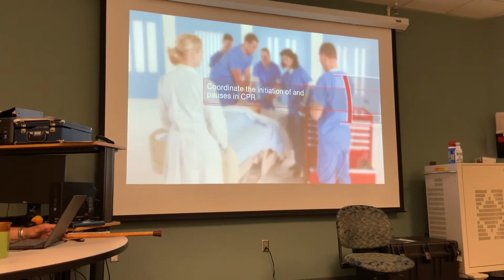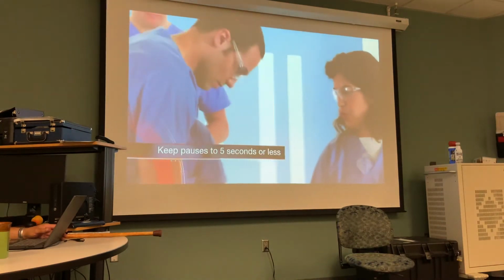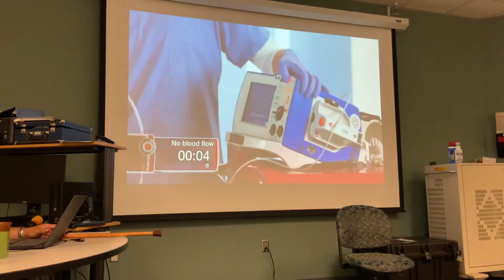The CPR coach should also coordinate the initiation of CPR and pauses in CPR. These actions can include initiating CPR, placing a CPR board if needed, analyzing the rhythm, switching compressors, defibrillating, or intubating the patient. The goal of the coach is to keep all pauses to 5 seconds or less when possible. Switch. Okay, Nadia, go ahead and start. And shock. Clear. Shock.